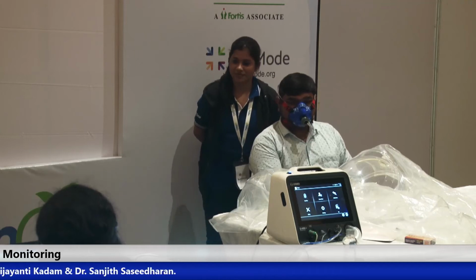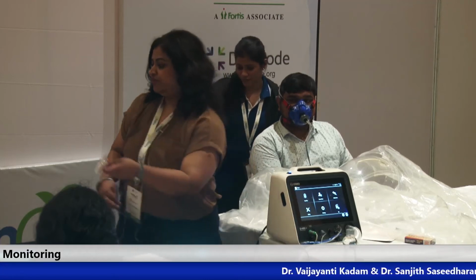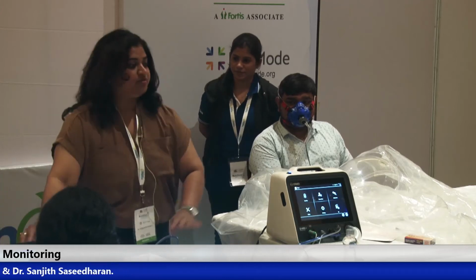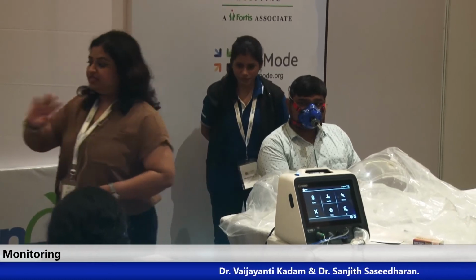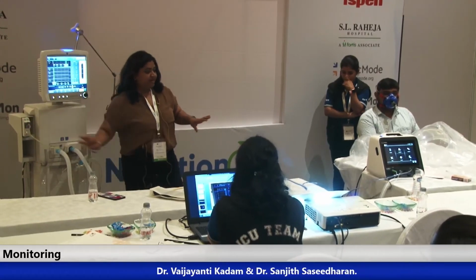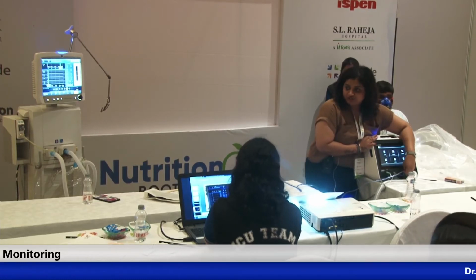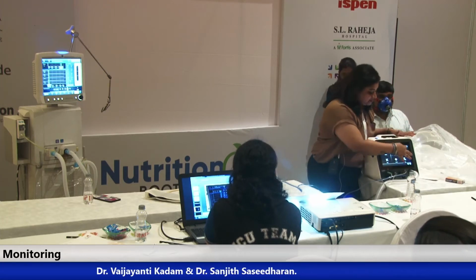Yes. Patient is on a ventilator. I take this machine and connect it to the ventilator. I've connected it to the ventilator over here, and I start getting my readings. The best part is that with this machine we usually get the steady state very quickly, because dilution is occurring in the lungs, the gas exchange is occurring in the lungs, and it puts in the Haldane transformation and gives us the result. As against this, the other machine directly calculates the volume of oxygen and carbon dioxide, puts it in the Weir equation, and gets us the REE.